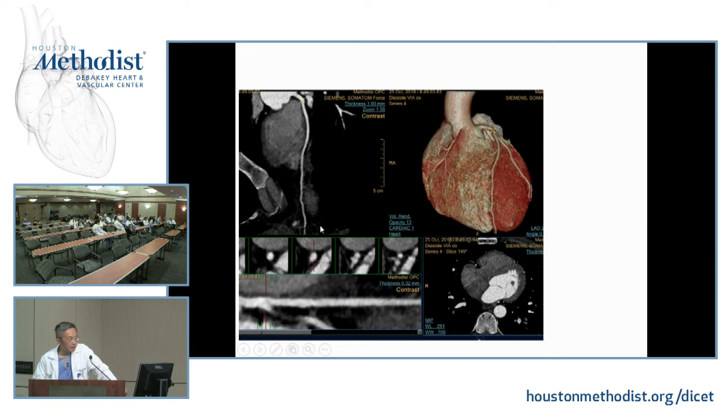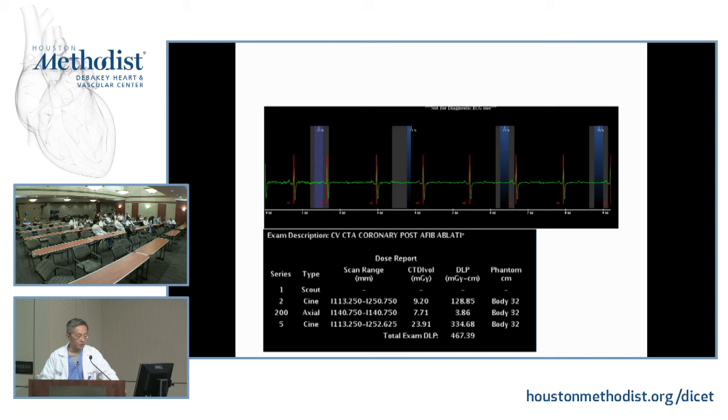And this is done here with our scanner. By the way, with the GE scanner, we cannot do flash mode, so we did prospective gating, all right? At 75% of the cardiac cycle. So this is done with flash mode, okay? I mean, the image quality, they're both normal. But I want you to pay attention to the difference, because of the scanner, in the radiation dosage the patient received, all right?